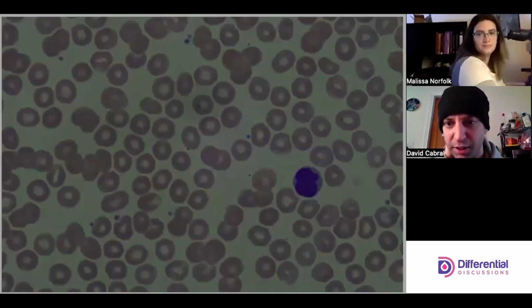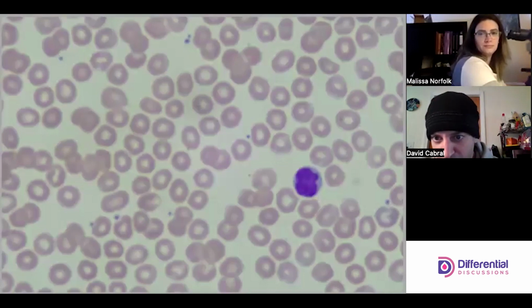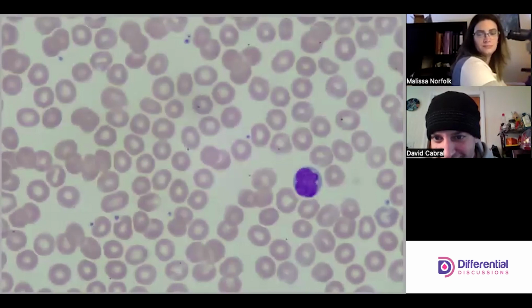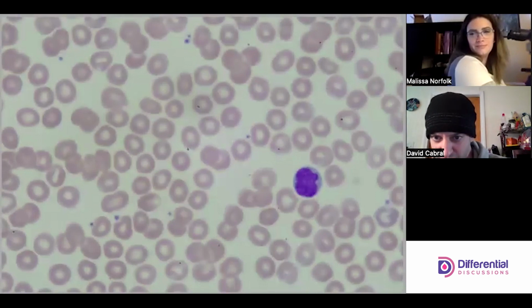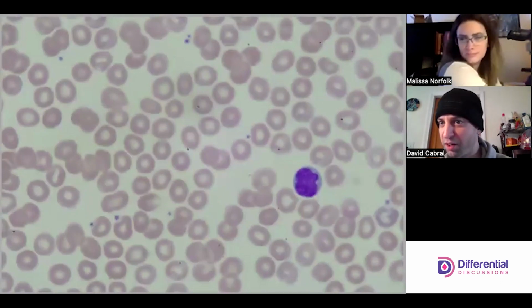So I want to pay attention to that. Whoa. I gotta be patient here. It's a little out of focus.